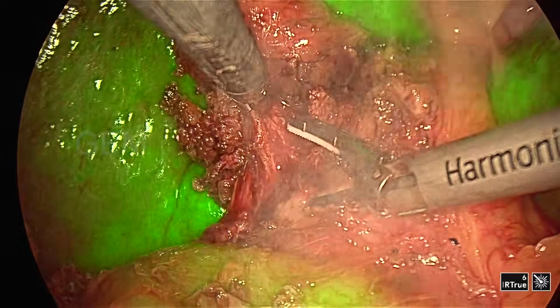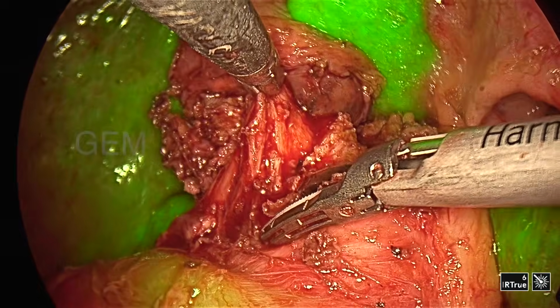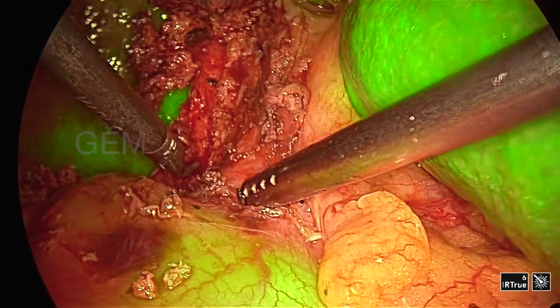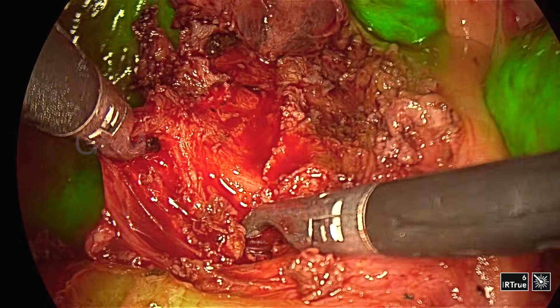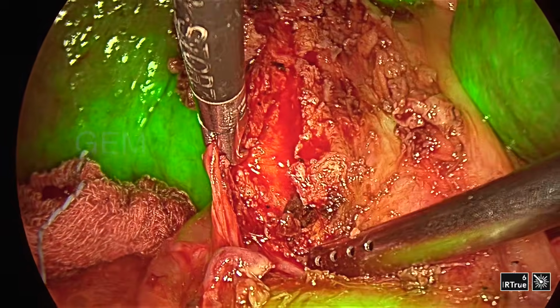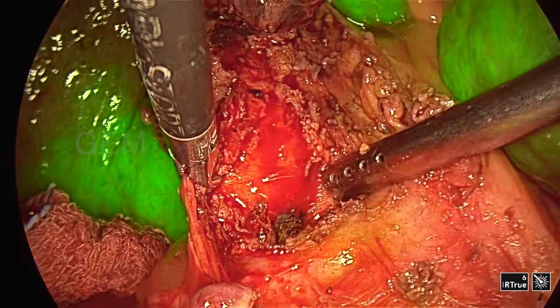So with the help of ICG, boldly I am opening the medial side of the cystic duct. That is the cystic duct and CBD junction I am opening. That is the level where it is inserting into the CBD. Because of the ICG help I am doing this. So now you can see the stone. It's an impacted stone. It will not come out because it looks like there is tissue overgrowth on the stone.